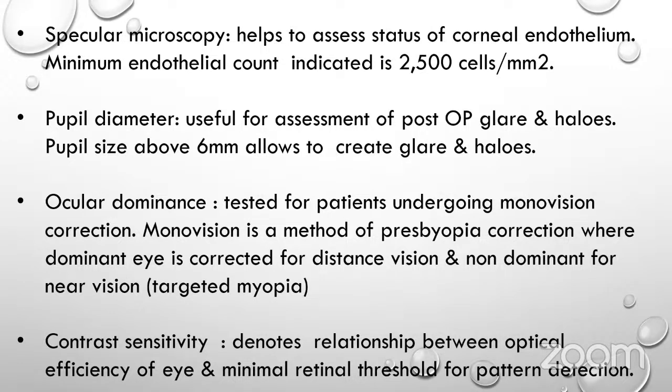Yes, anyone else? Sir, on Pentacam, the method is pupillography.